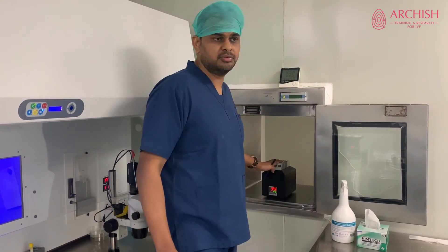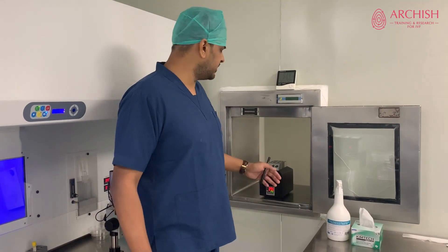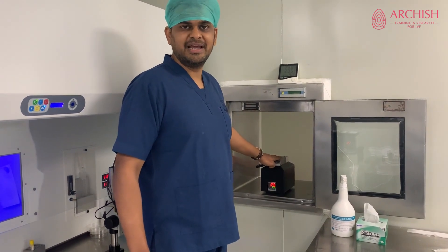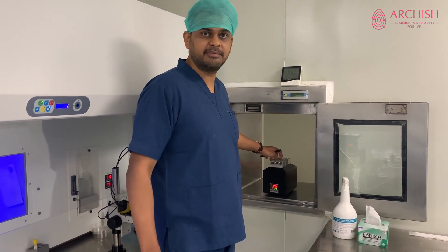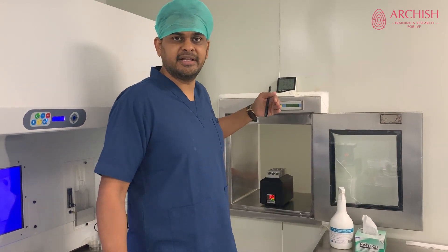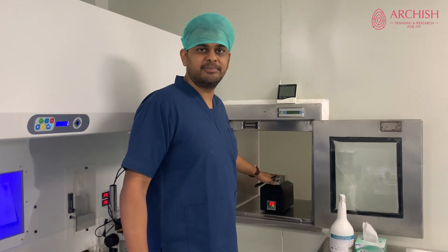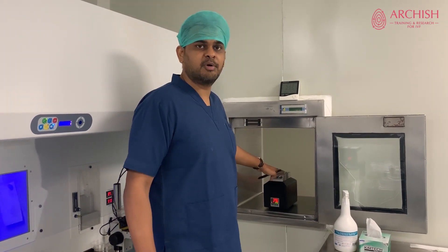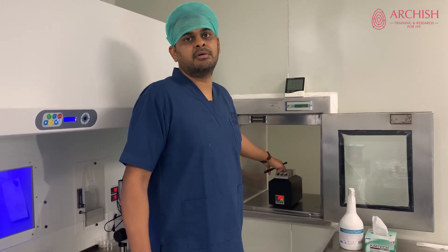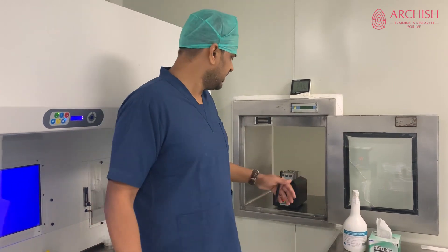The heating block is an intermediate holder during pickups. The follicular fluid is collected in test tubes, which are held inside these heating blocks while the embryologist finishes screening the current tube. The pickup can't stop, so follicular fluid tubes keep coming in and being held in these heating blocks. That is why it's important the heating block stays at 37 degrees — if not, the blood will clot and you won't have the eggs you were expecting.